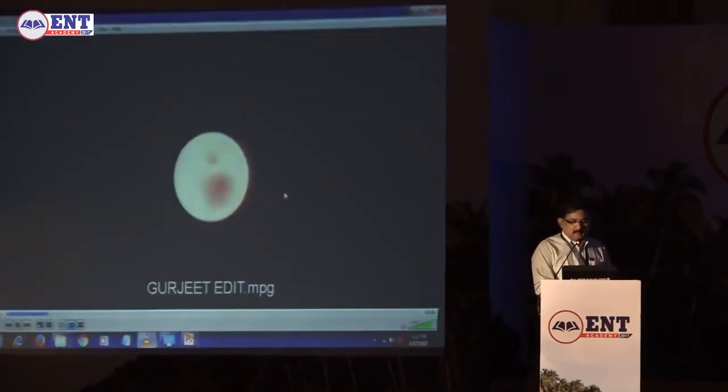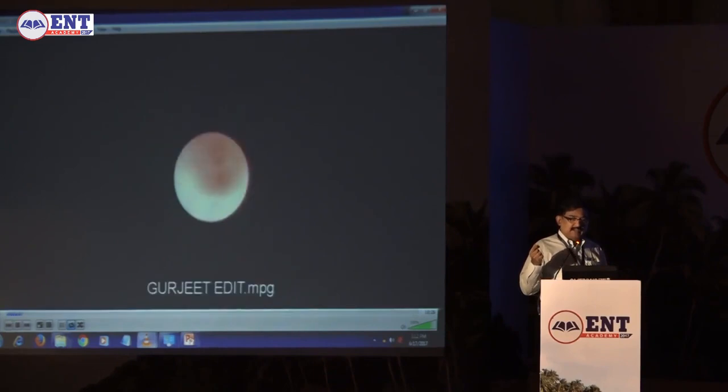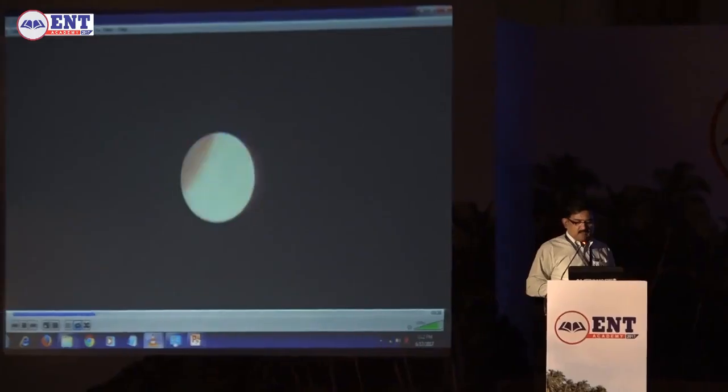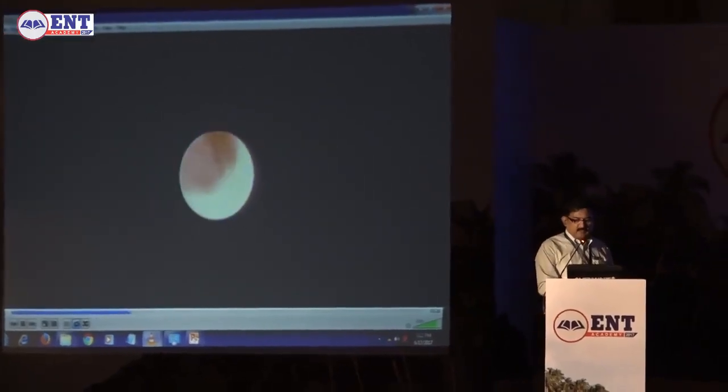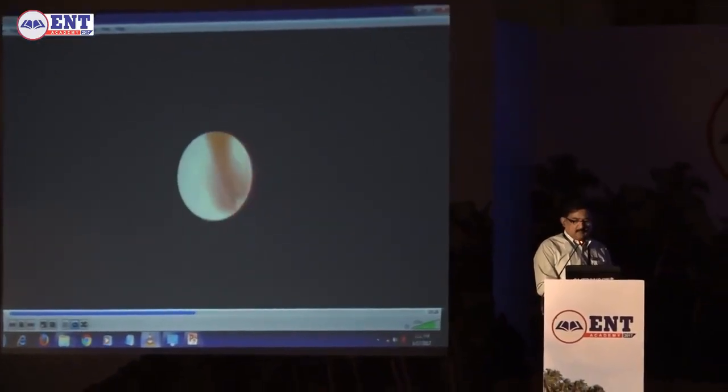It's a patient from New Delhi who was offered open surgery there, who wanted to get it done by scopy, and this is by using a basket. The basket itself is a dilator. If you open the basket within the stricture, the basket itself becomes like a dilator. The duct is so thin and fine. You can see the stone there. The basket is going.